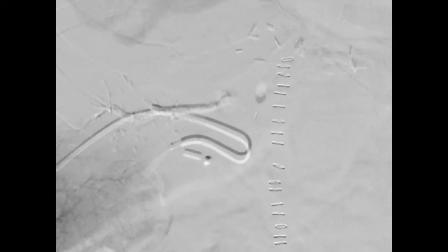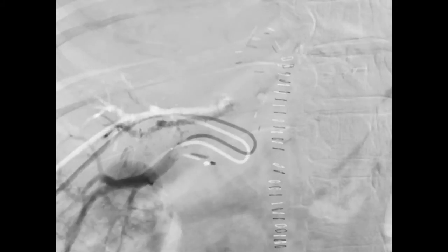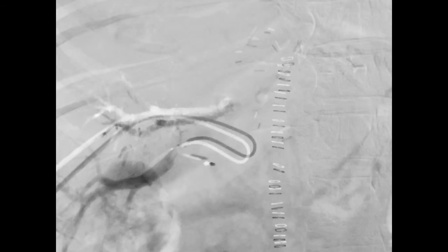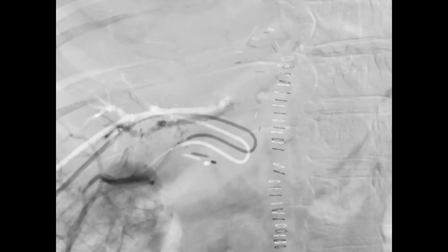Here you can see I reposition my direction microcatheter. In this case I was able to do it without a need to reinsert the wire. That's very helpful, as in those cases where I use Glubran and lipiodol, normally your catheter is a little bit filled with these substances and it can be very hard to reload your wire. Direction microcatheter is enabling you to reposition without a guide wire.